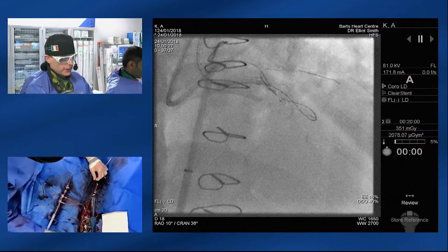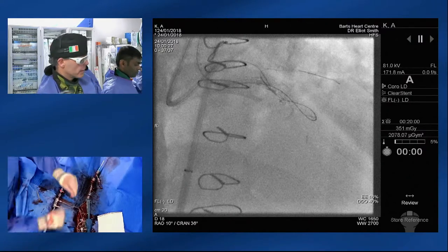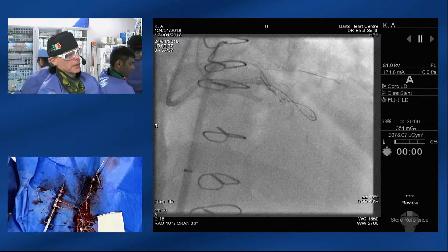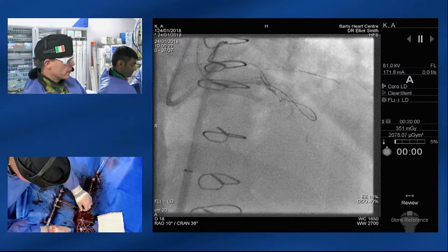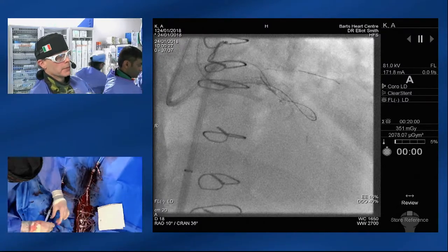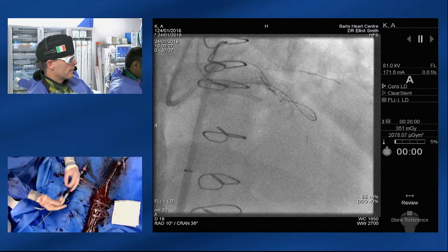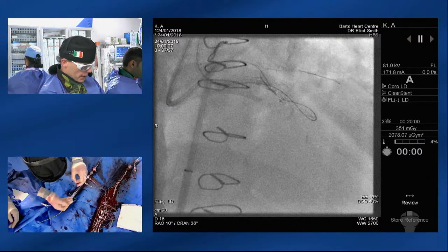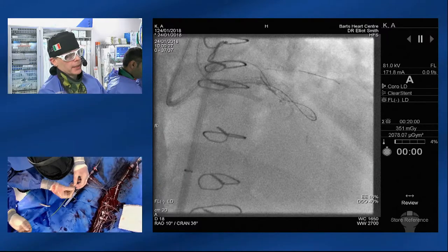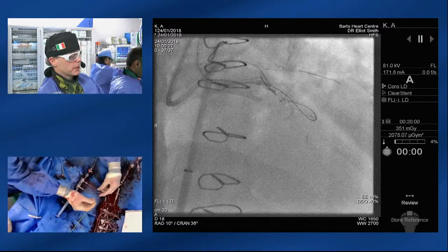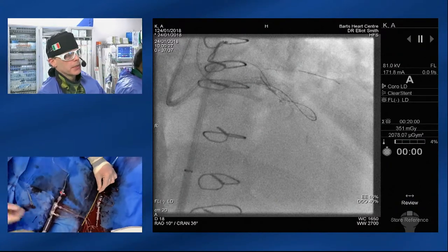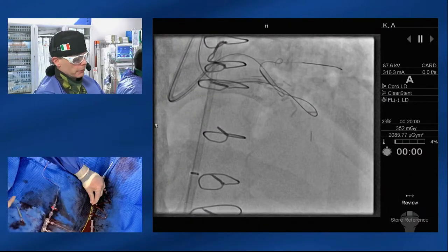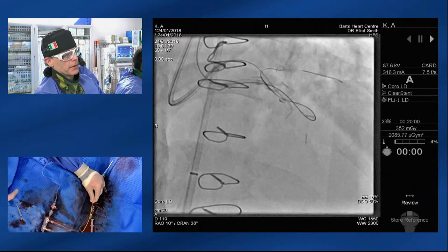People are a little alarmed about ballooning the sub-intimal space — is that not dangerous? The whole tensile strength of the vessel is largely dependent on the adventitia. Within the sub-intima, we're within the adventitia, which is about three or four times as strong as the media or intima. We're using the principles of a compliant adventitia to create a common space. Unlike plaque, it doesn't recoil — you don't get recoil within the sub-intima because you don't have plaque. You've got a very blood-rich, friable material which dissects very easily.